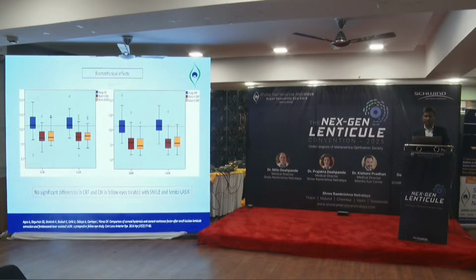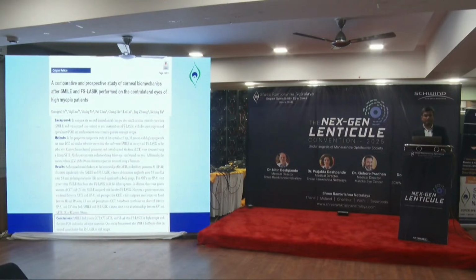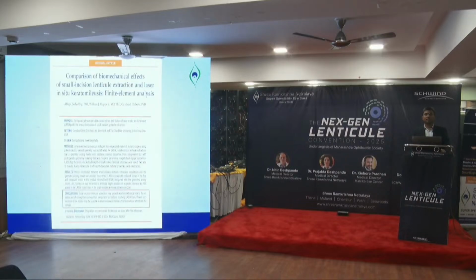But however, there are other studies which show that SMILE had a lesser effect on corneal biomechanics than femtosecond LASIK. So each of these machines has its own limitations. But in mathematical models and in finite element analysis, it has been shown that any lenticule refractive surgery procedure is much better than LASIK flaps.